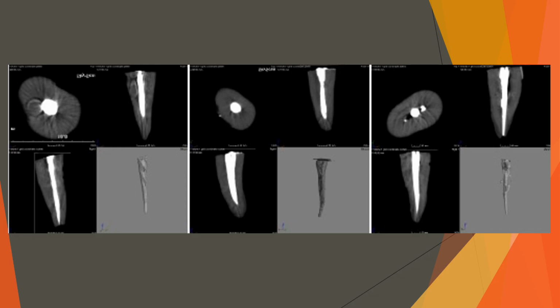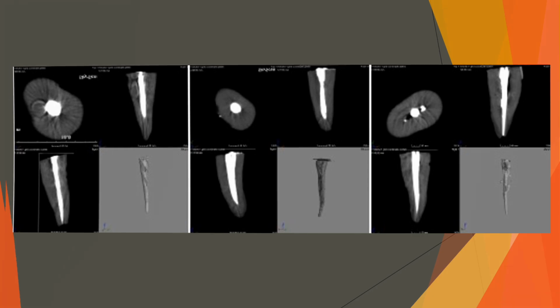there are spaces between the cones of the obturating material. That means that there is not a hermetic seal, there is not a tight seal, and there are spaces between the cones, so there will be leakage in these cases. So we have to make it like the other picture: the gutta-percha must seal all parts of the root canal, all over the root canal from the apical to the coronal.